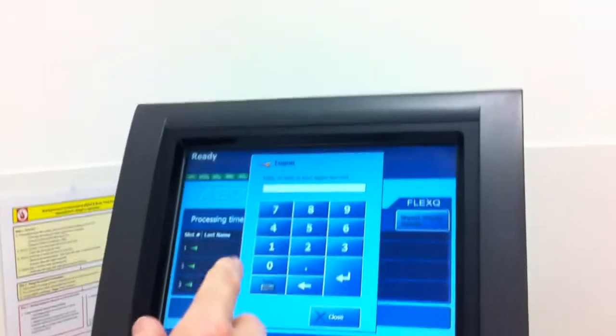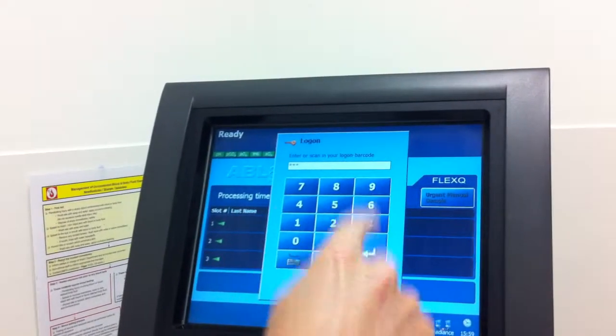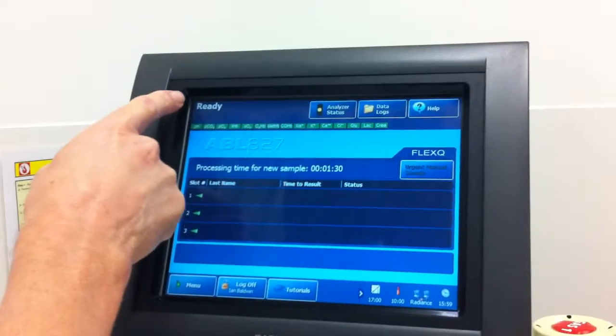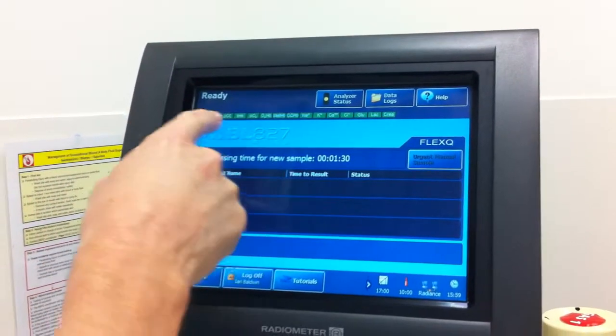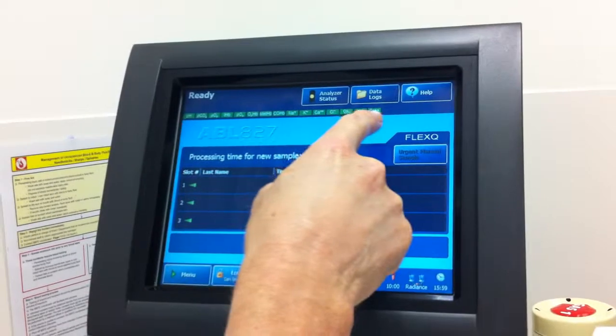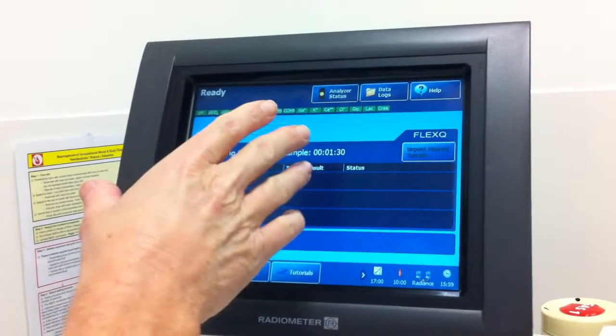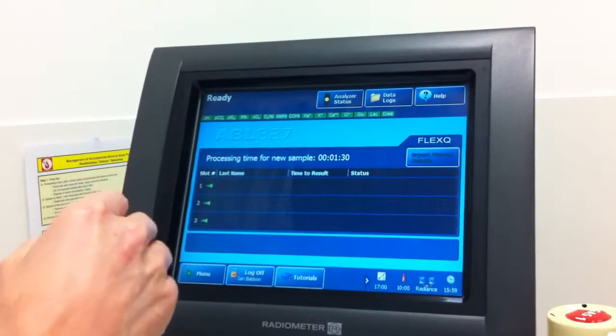So this is a logon. You can use a barcode, but I'll put my number in. The screen comes up. You can see it says ready here. There's a number of little green buttons across here, which tells us all the parameters that the machine will record in the sample.